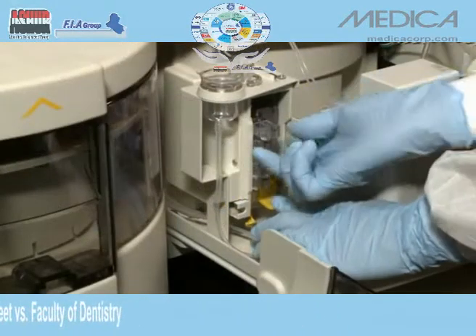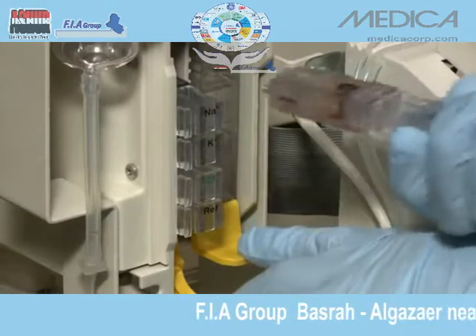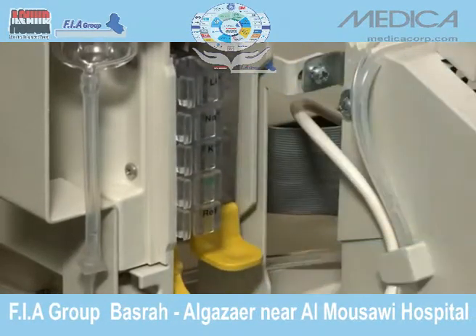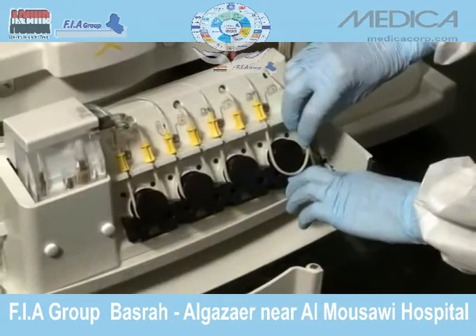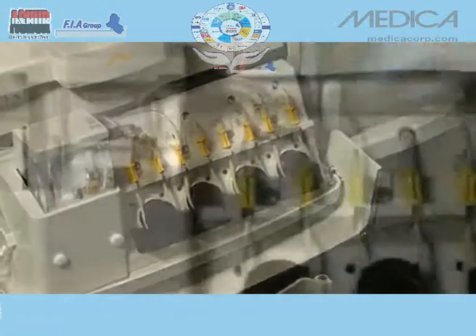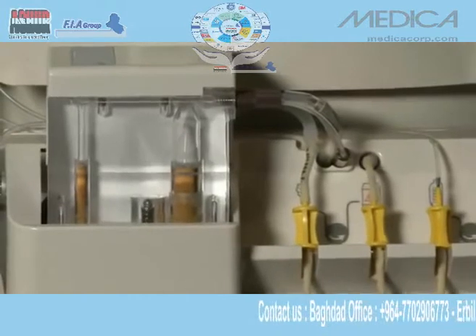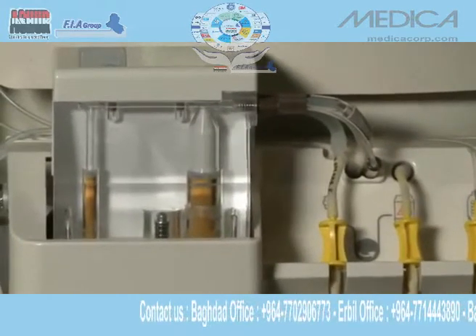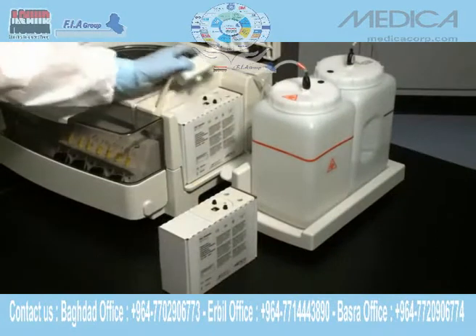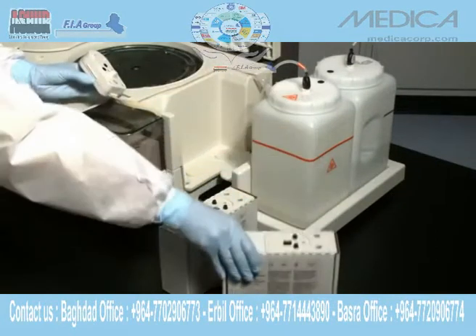The onboard ISE module is fully accessible for replacement of the economical, no-maintenance snap-in electrodes. Pump tubing and other consumables are easily replaced. The precision diluter pump seals are maintenance-free. The transparent design allows for easy inspection of solutions. ISE reagents are contained in a convenient, disposable reagent pack.